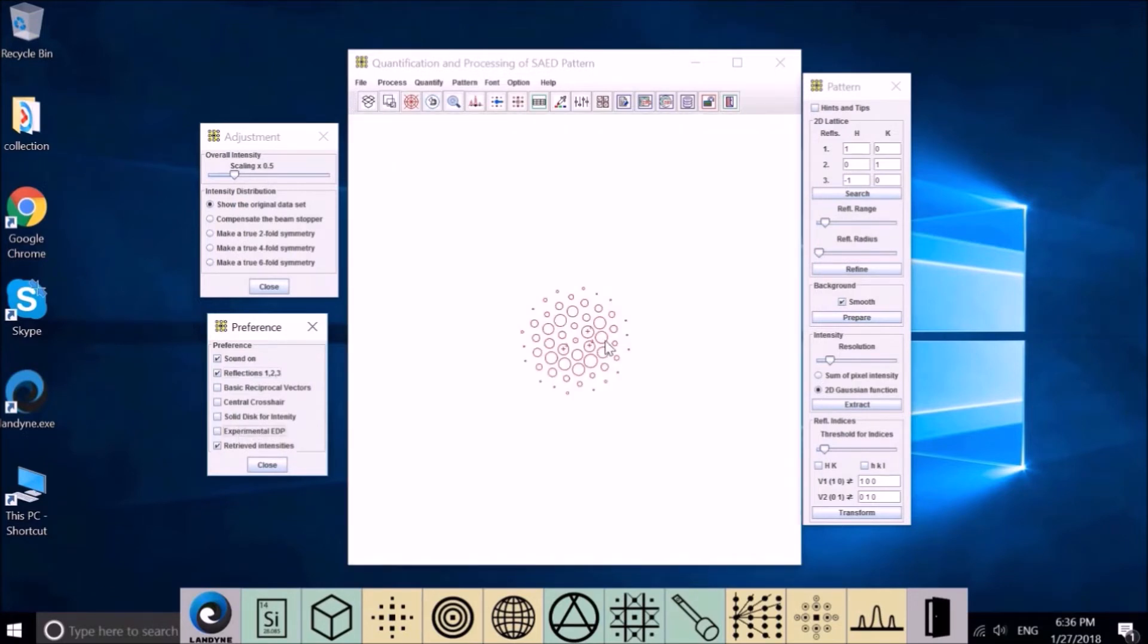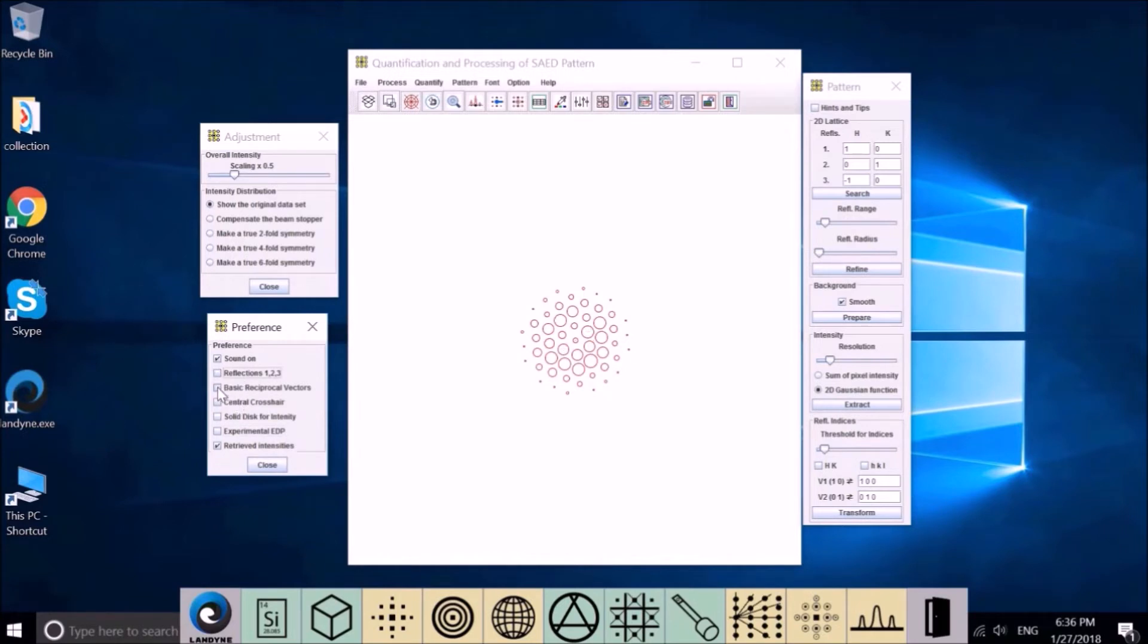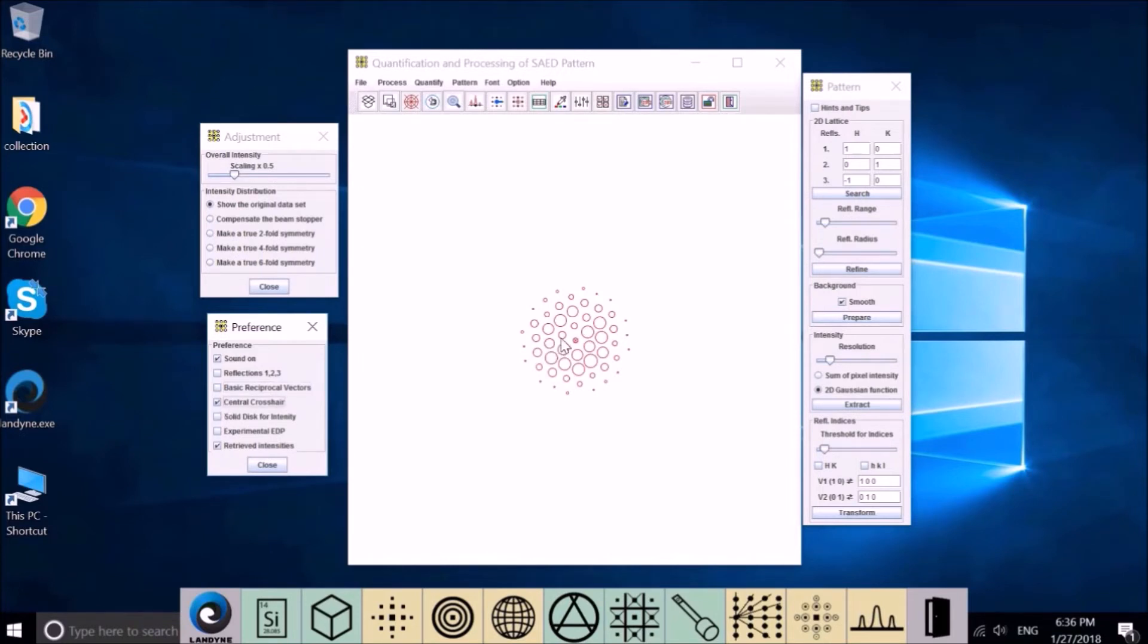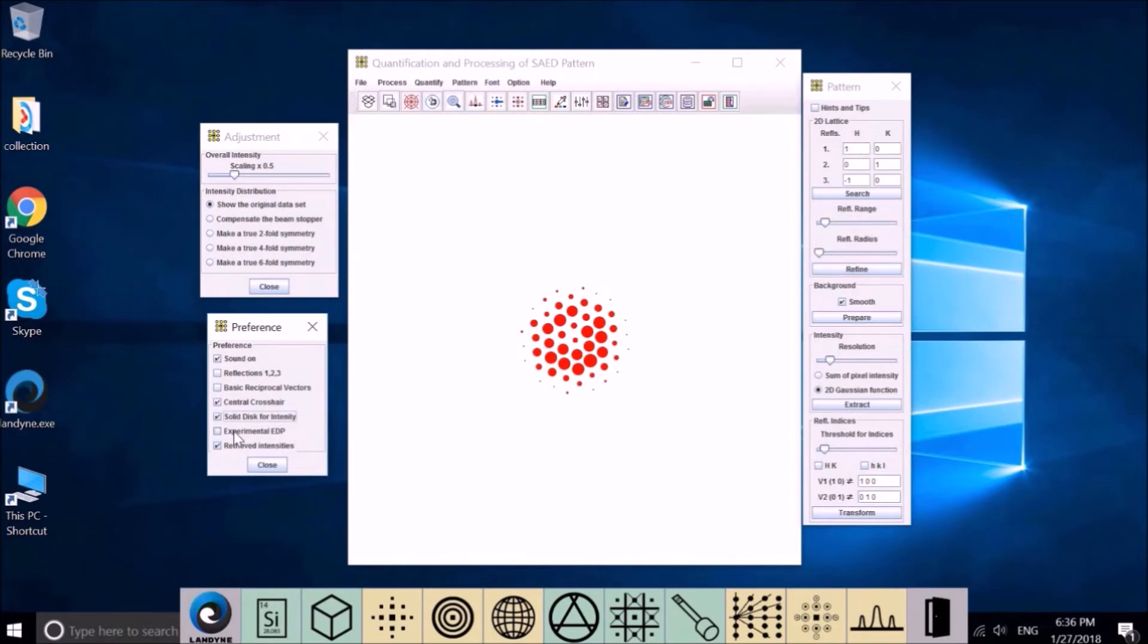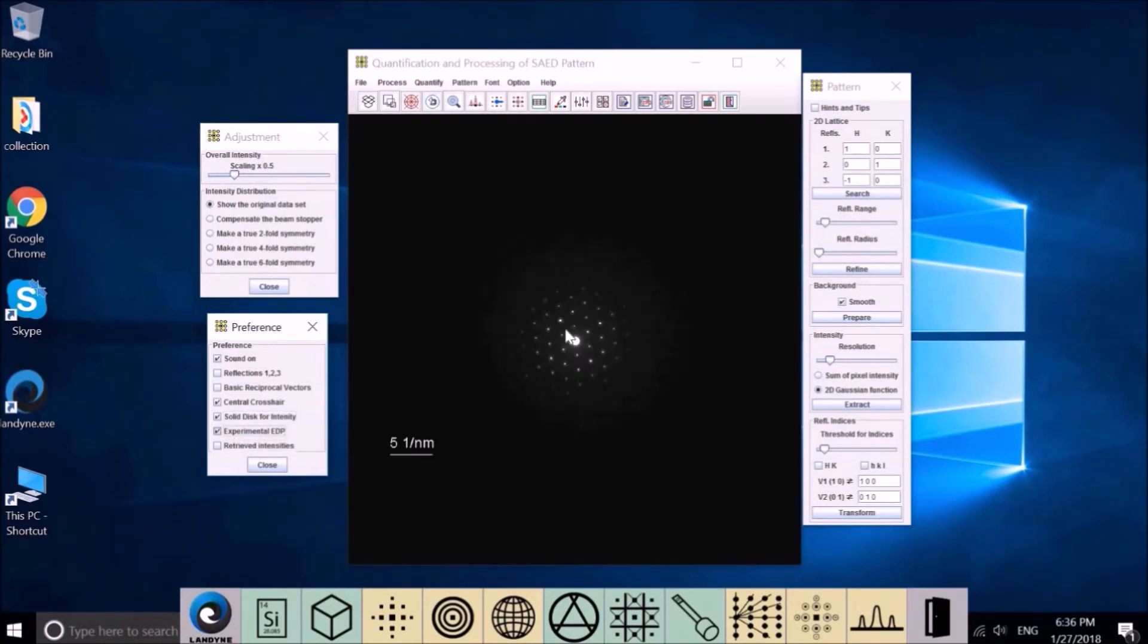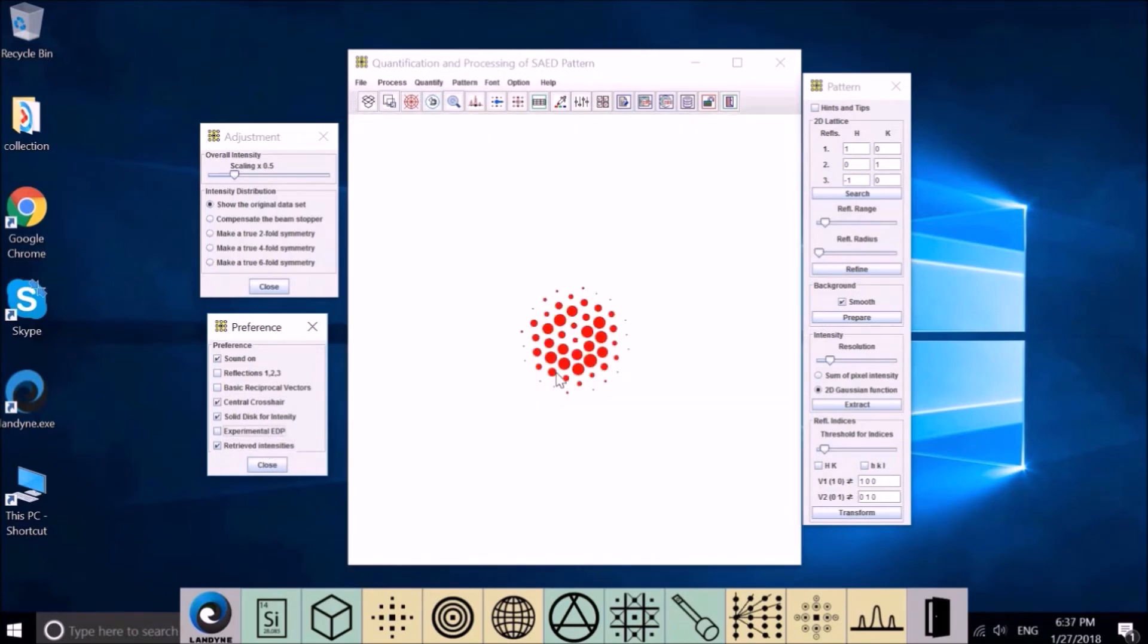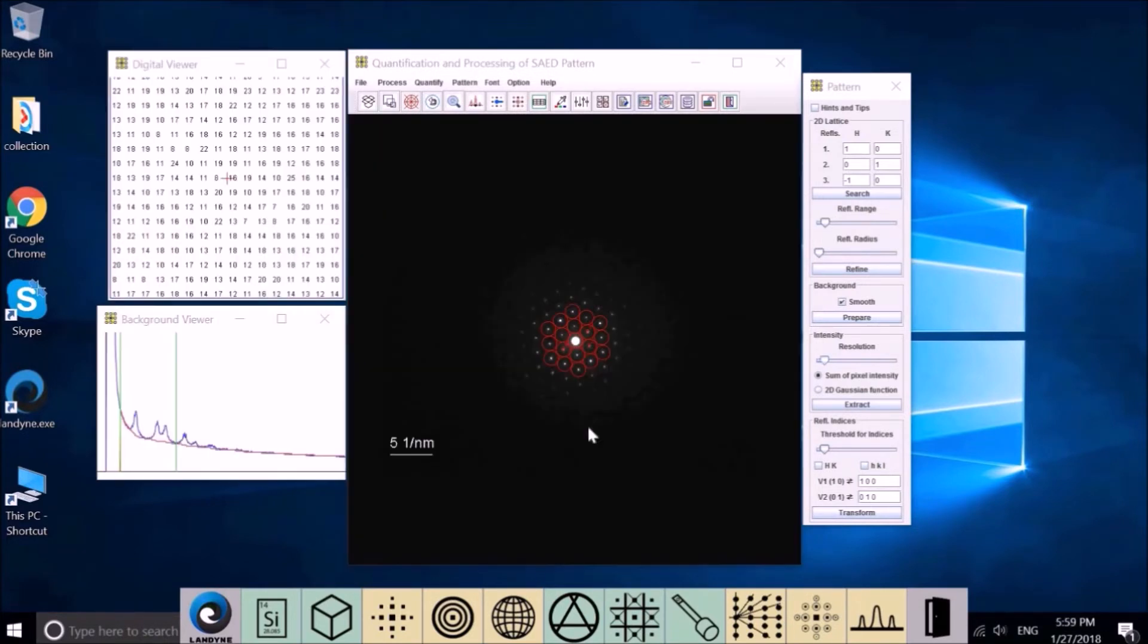Let me first remove the experimental pattern. The three spots you don't want to appear here, so you can turn it off. You can show the basic diffraction vector on or off. You can put the central beam on, marked with cross. You can turn the intensity to solid, so make them more revealing. You can choose to only show the diffraction patterns without retrieved image by making the swap.